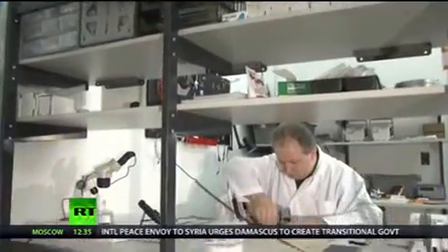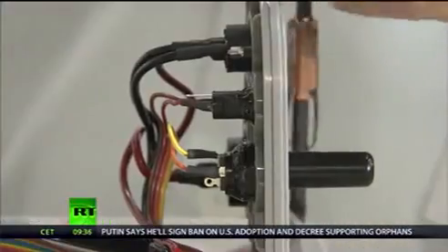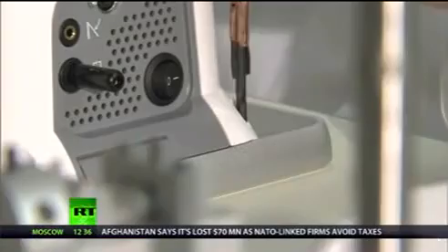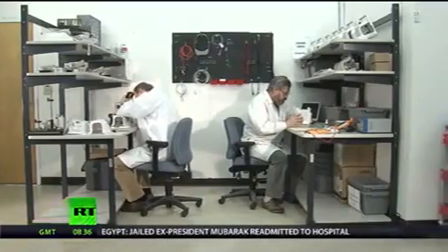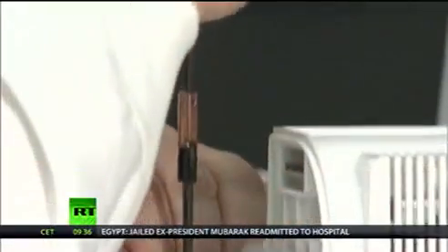Here in the U.S., the lasers are marketed as Alta MS lasers. The model you see here is designed for soft tissue surgery, but the company is currently working on a new module with a fiber ending designed especially for cutting through hard tissue like tooth enamel and dentine. The unique design means dentists can simply swap out the soft tissue scalpel for a different one. In theory, that means dental surgeons won't have to invest in an entirely separate console for different purposes.